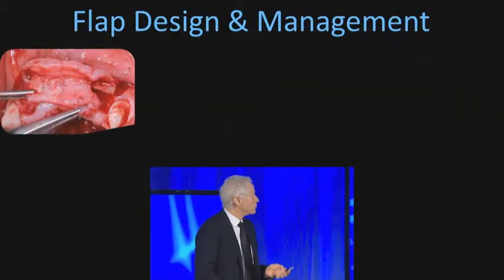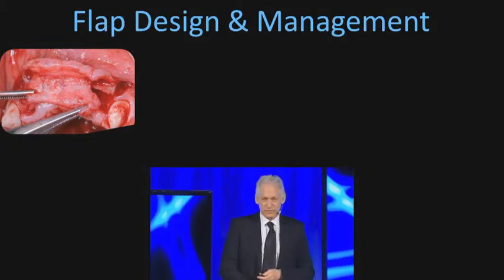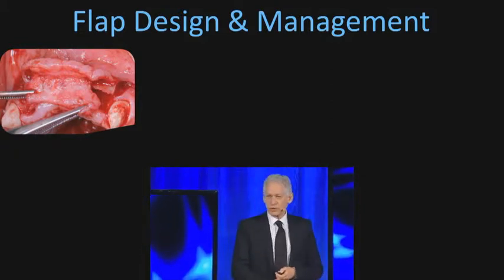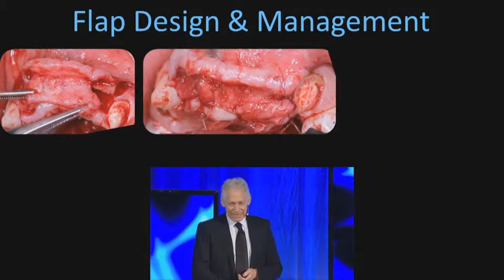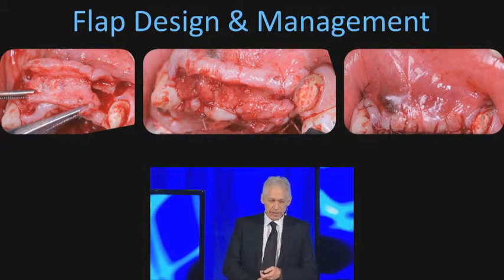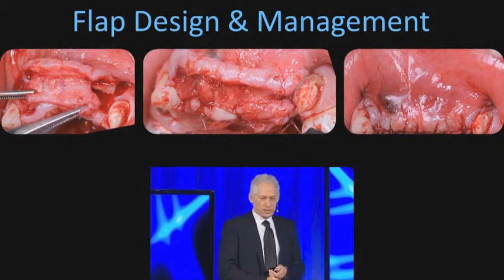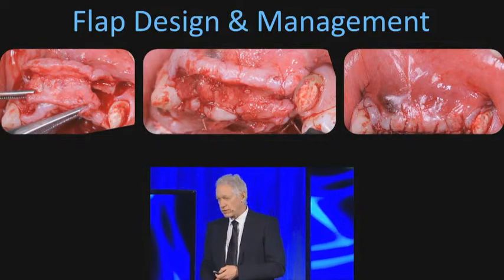So then you measure. It has to reach the edge flap passively, without any tension. So you will not have early exposure, you will not have any dead space, therefore you'll be successful. Now, the internal part of the flap will be sutured to the edge flap, and you complete your advancement. This will give you a much better color match. That's exactly what the patient wants. The prosthodontist would want that, and it will limit shallowing of the vestibule.